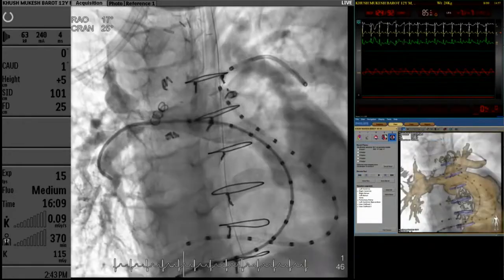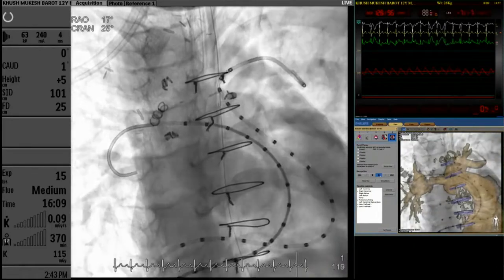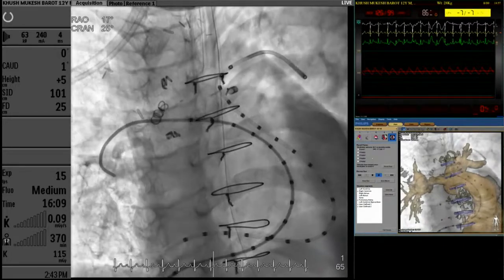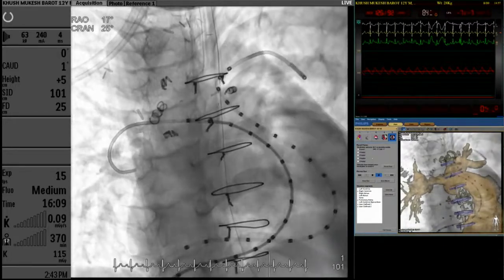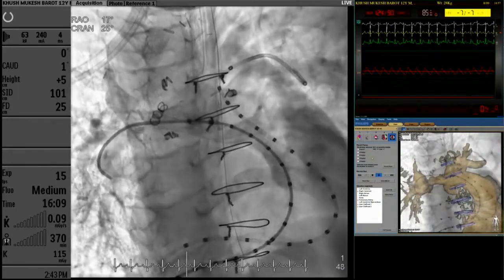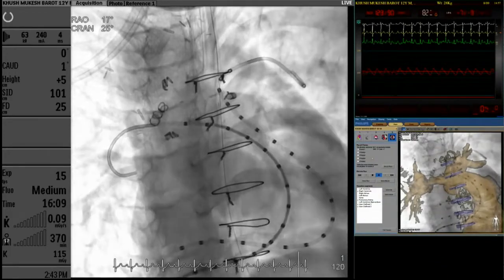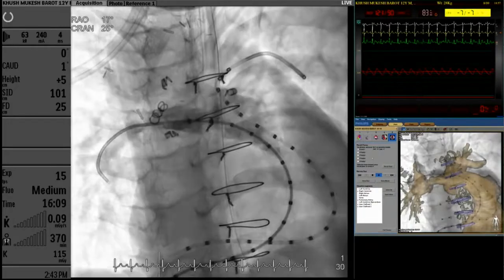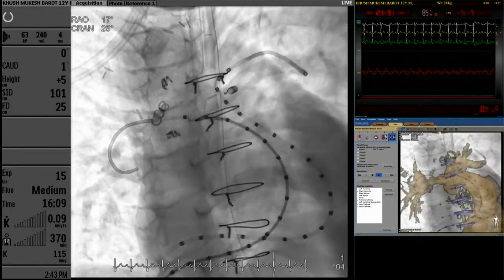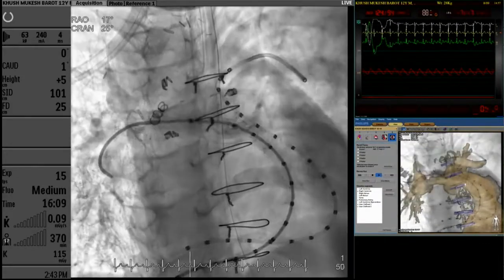Now, the second concern is, would you think about compliance testing? Because this right pulmonary artery was not a native vessel at all. It is partly Gore-Tex and partly bovine pericardium. So would you like to first test the compliance before taking the stent? Because if the stent is not expanding at all, that would be a good idea, I think. I think it looks quite compliant and pulsatile, but it may not be a bad idea.